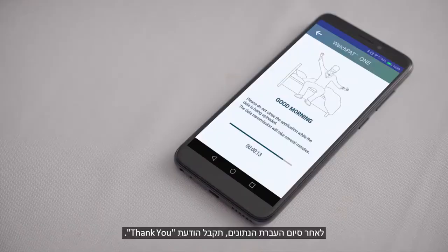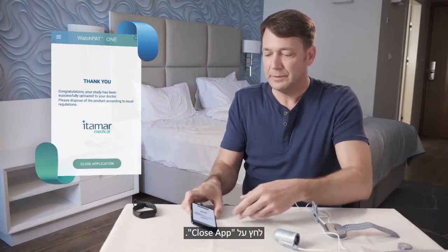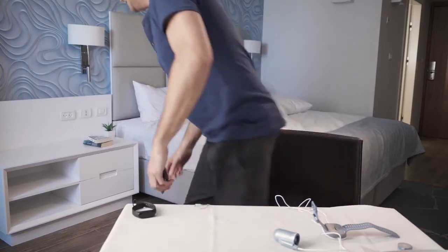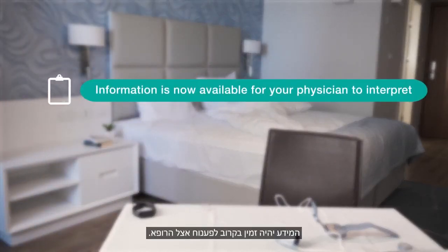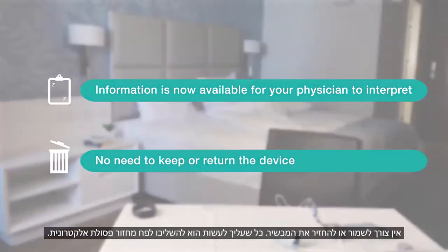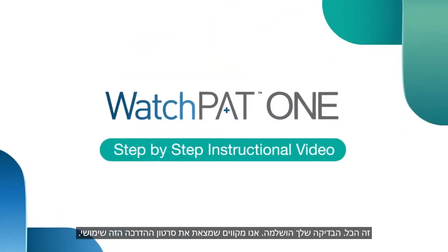Once the data transmission has concluded, you will receive a thank you message. Press Close App. The information will shortly be available for your physician to interpret. There is no need to keep or return the device — simply dispose of it. And that's it. Your test is complete.